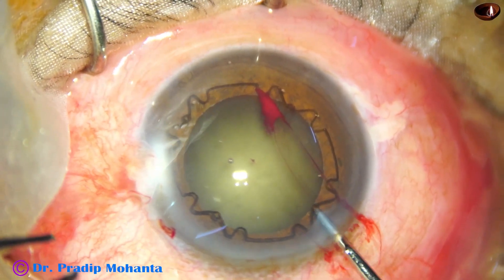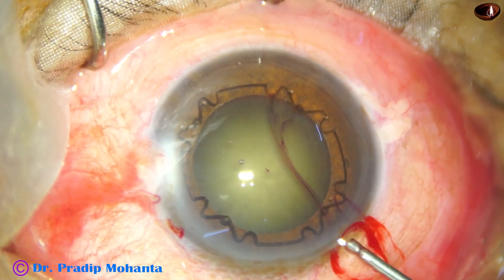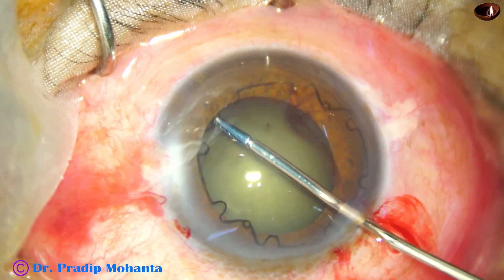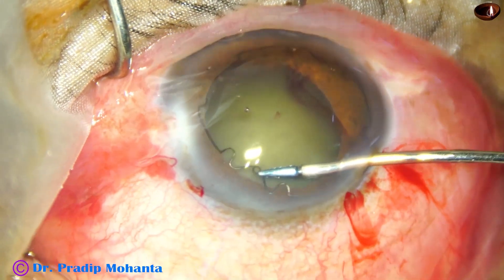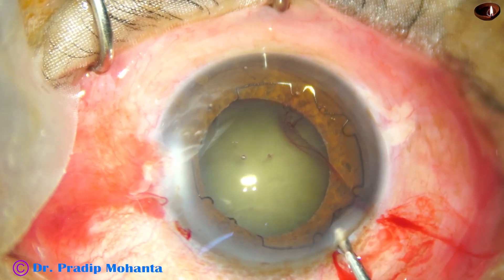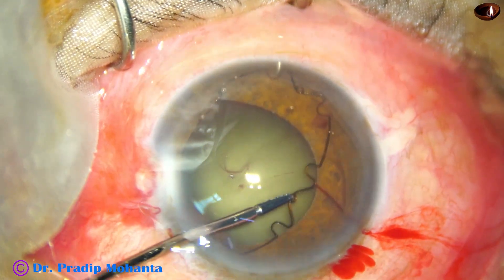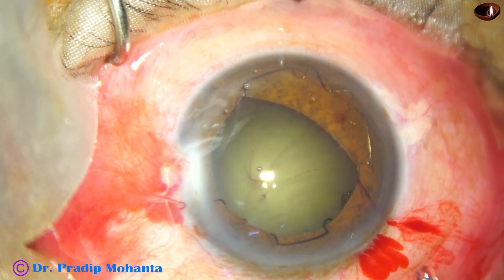This is looking not good — this blood clot has gone with the B-Octa, but it comes out easily. Now see the tucking of B-Octa. There are holes in it; just hold the hole and tuck it, and the alternate flanges are above the iris. You have to tuck four times — four flanges with a hole at the middle will go under the iris, and the plain flanges will remain above the iris. The pupil will take a beautiful octagonal shape.